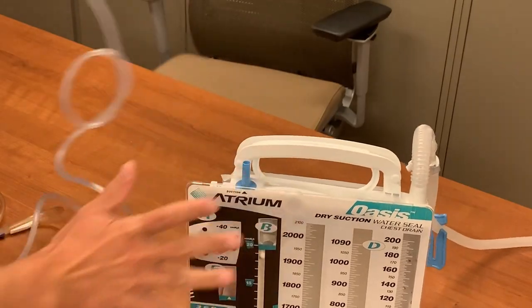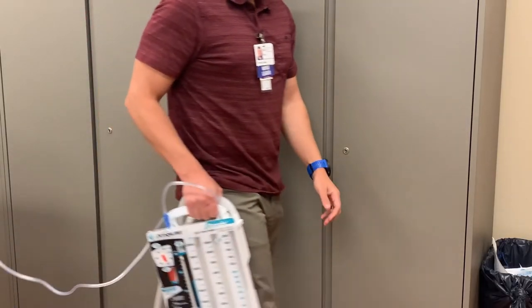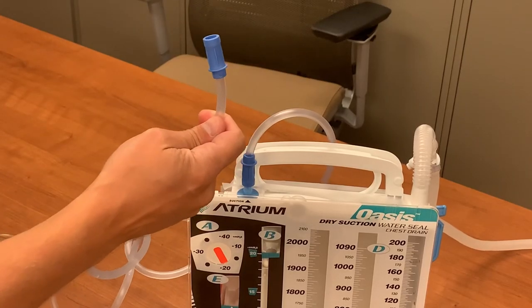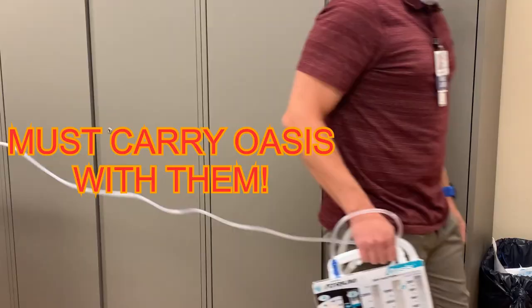For patients who can be disconnected from suction, simply disconnect the suction. They can now ambulate in the hallway, but they will need to carry the Oasis system with them — you do not disconnect the system from the patient. Some patients will be able to ambulate but will need to stay connected to suction. These patients won't be able to walk in the hallway, but could ambulate in the room. You can connect suction tubing extensions to the Oasis unit to allow the patient to move more freely within the room, and they will need to carry the Oasis unit with them as it will still be connected to the patient.